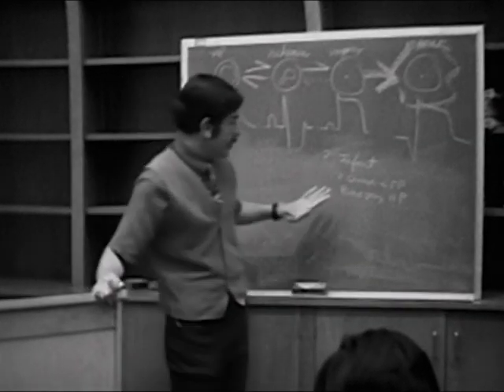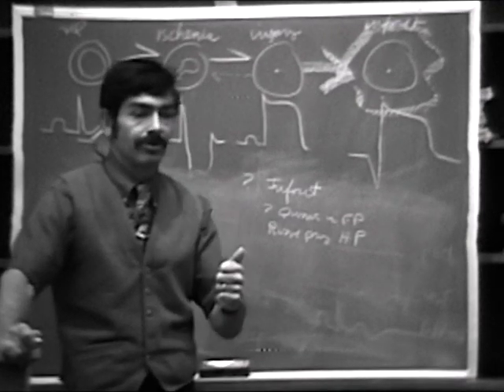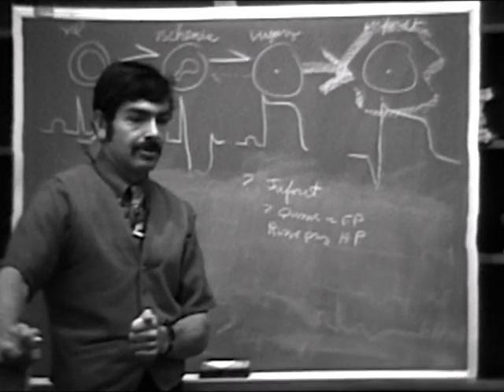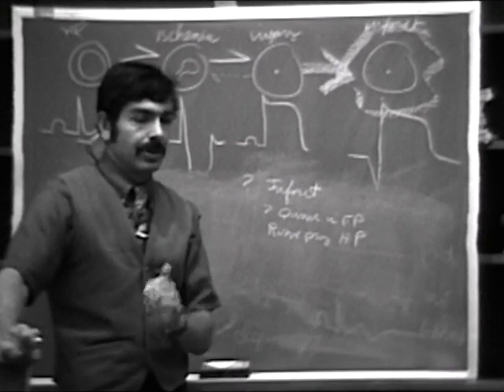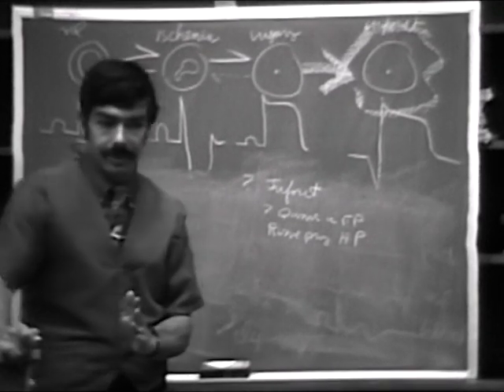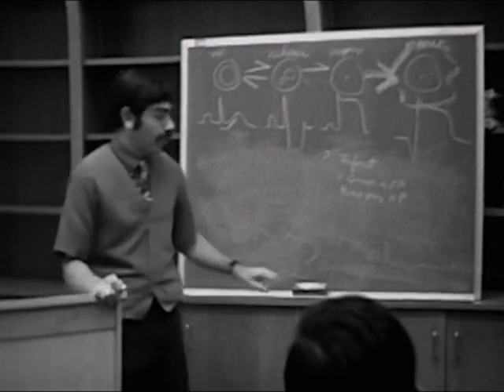Okay. If we do see signs of an infarct, then we want to ask ourselves two questions. What are they? What do you want to know about it? Where is it? How long has it been going on? Right. Where is it located? What surface is it located? And how old is it?